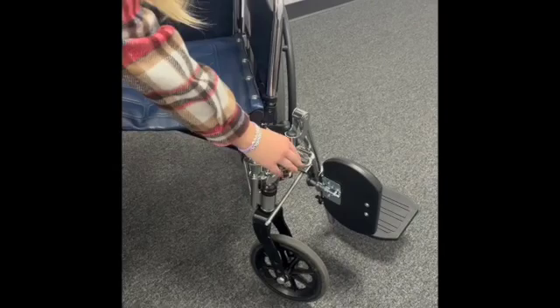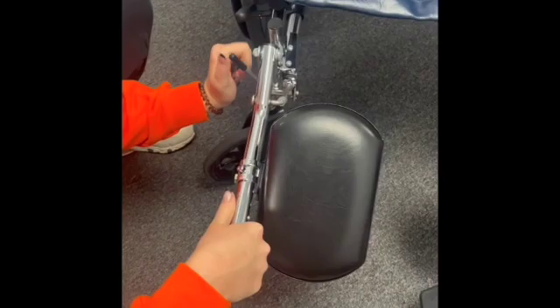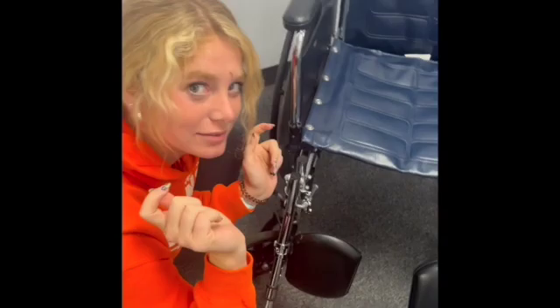You can also change the height — pull it out however you need it, and then you can drop it back down. Same thing with the other side.